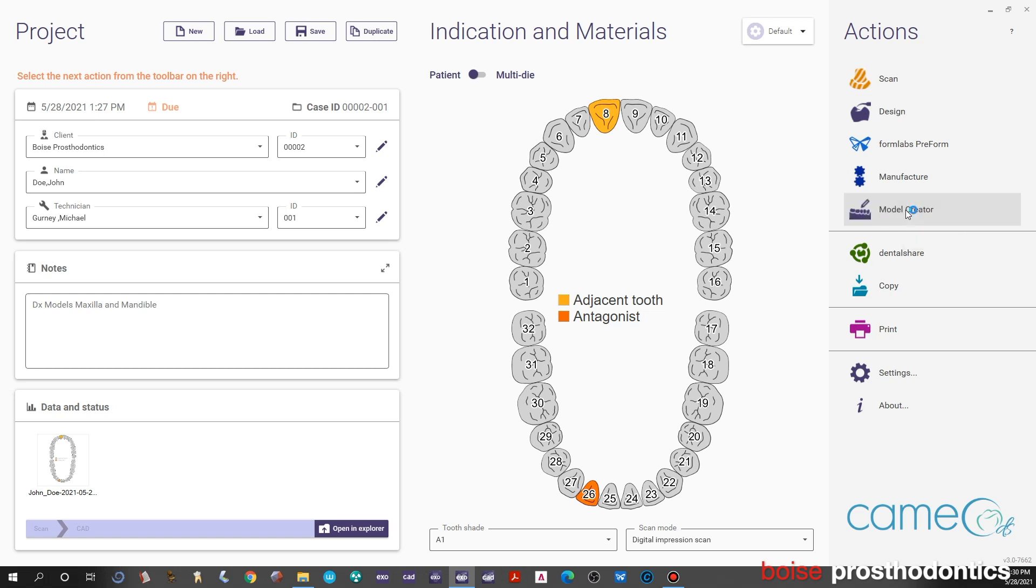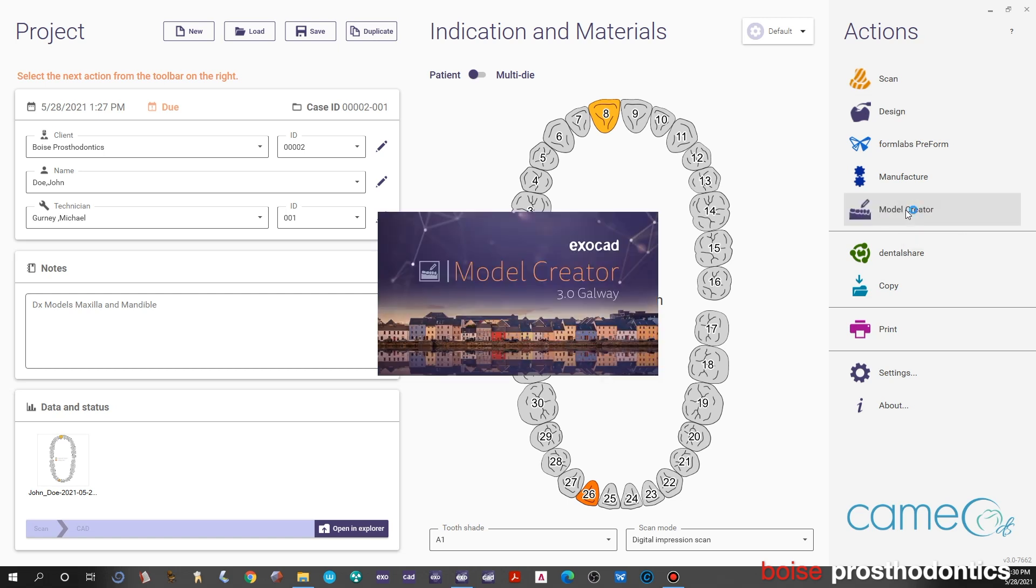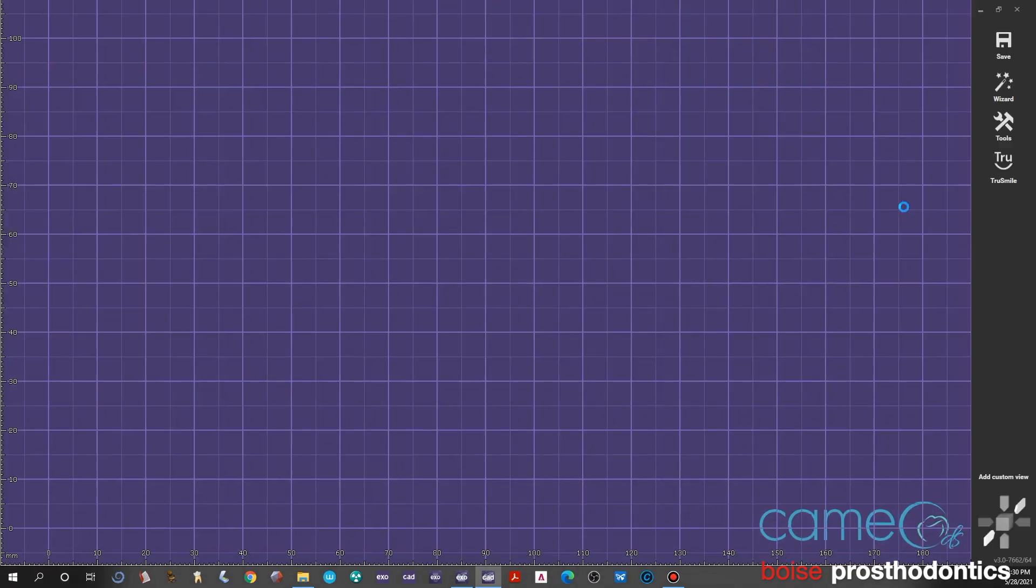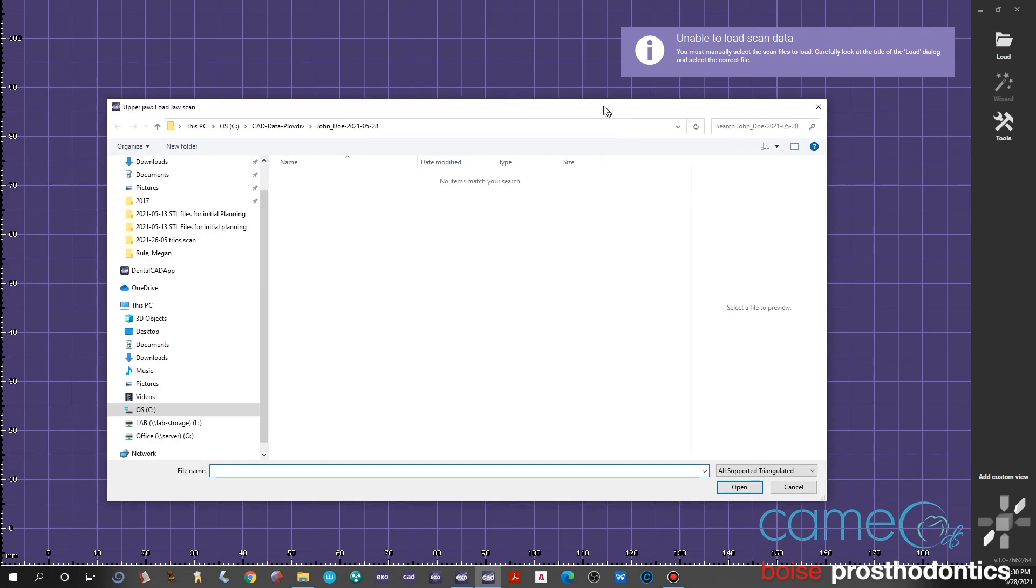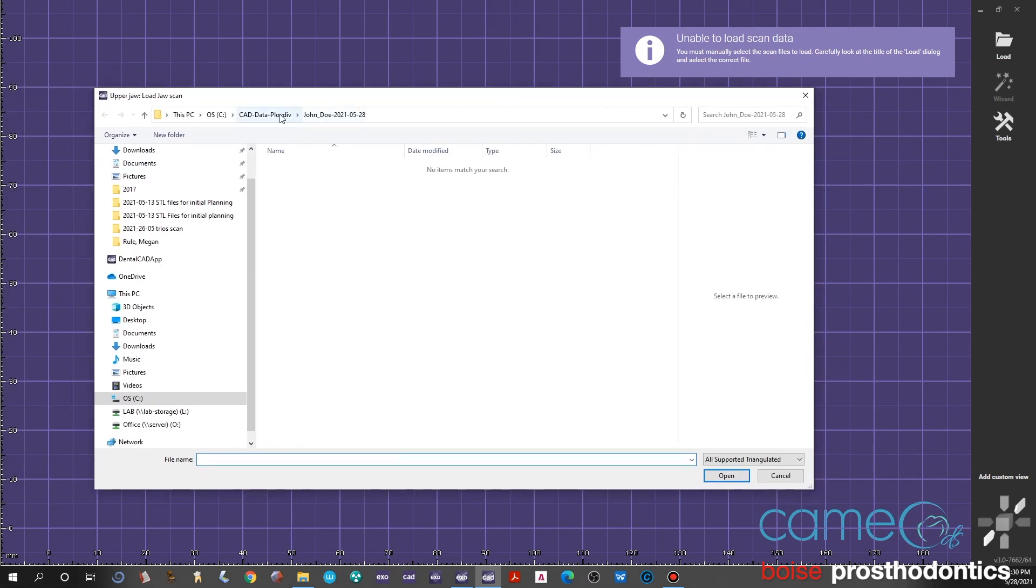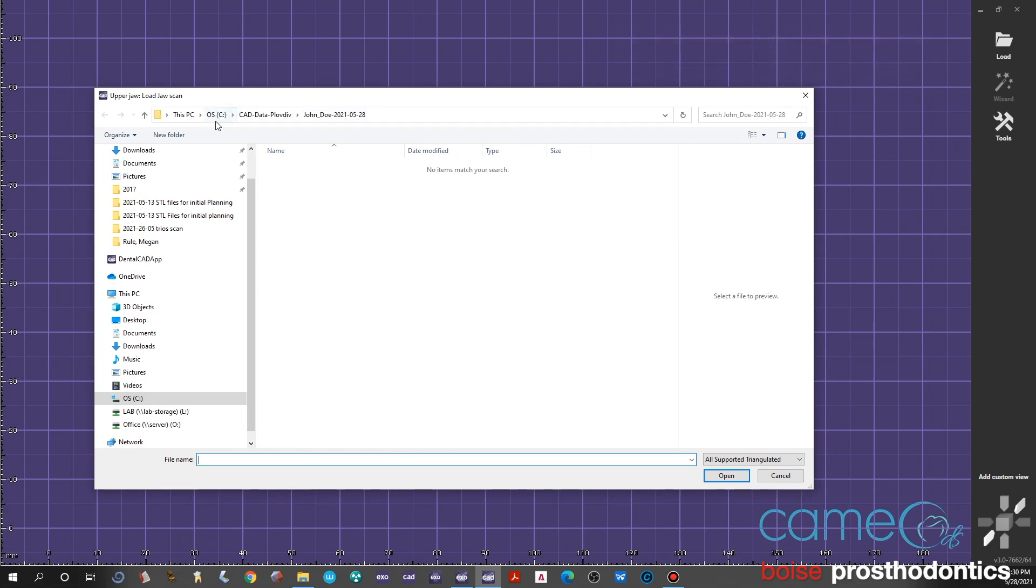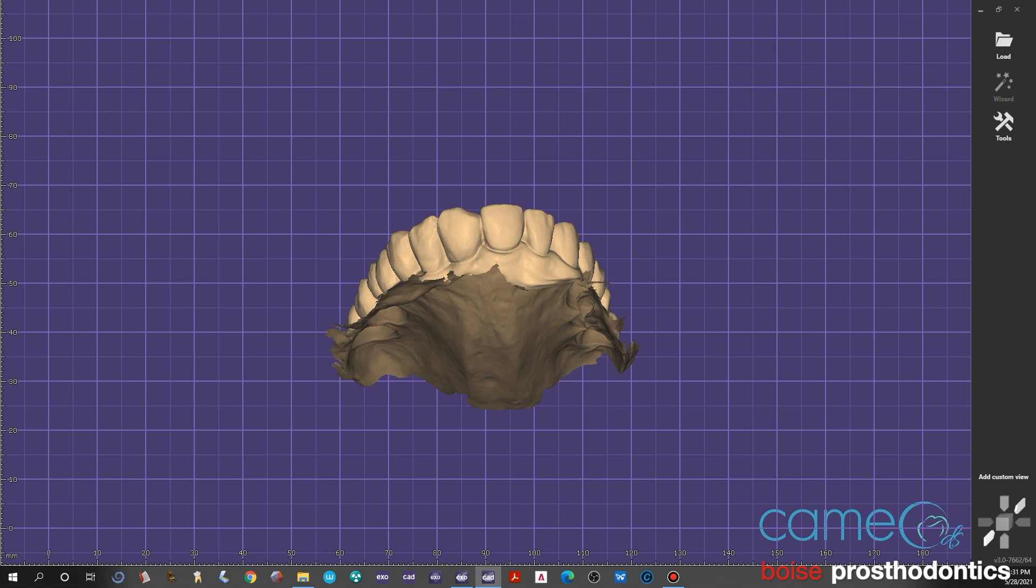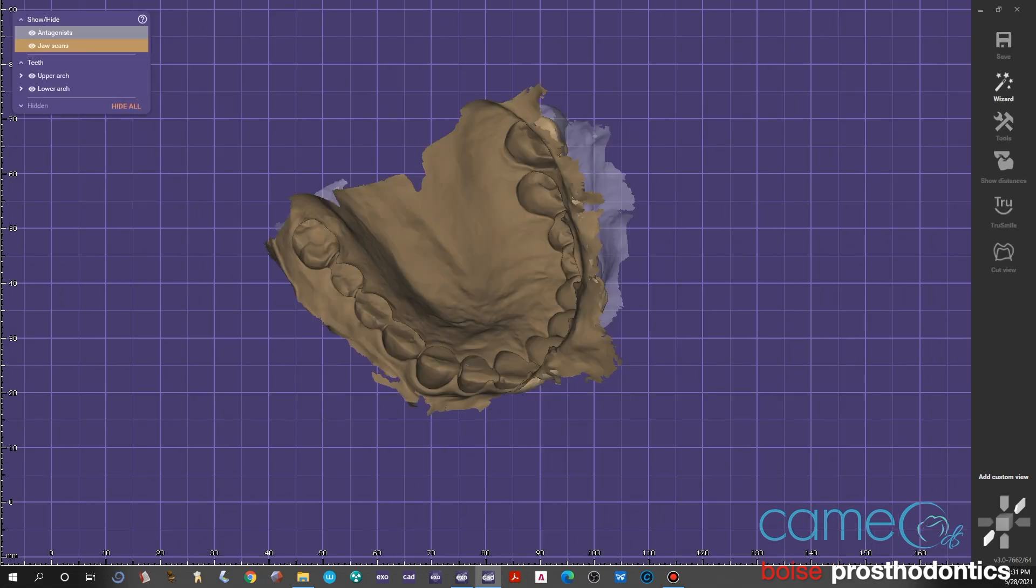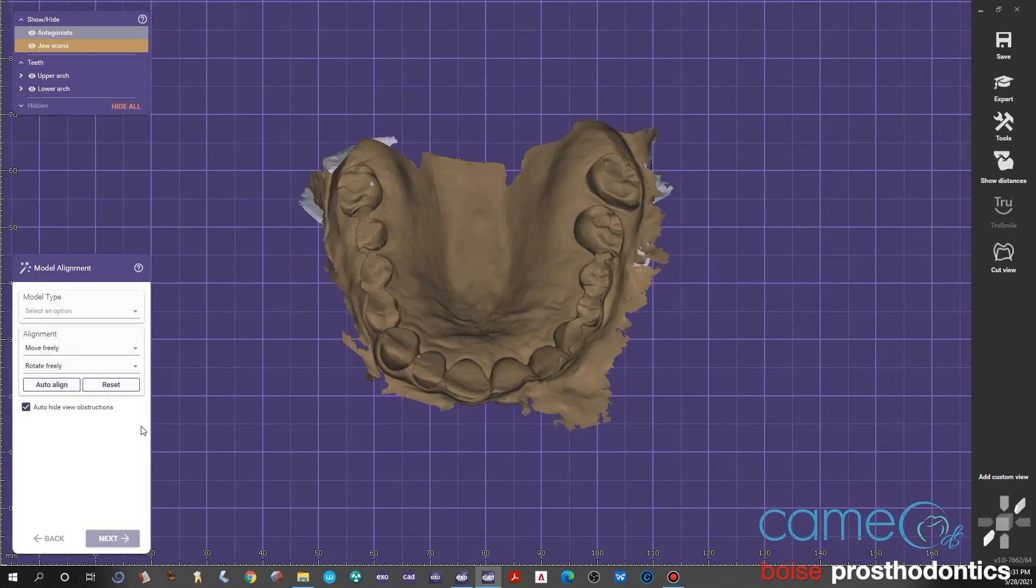Once we click on model creator, the CAD software will open up and prompt you to select the correct jaw STL files. The first one it asks for is the upper jaw scan—see in the upper left corner it says upper jaw scan. We're in the C drive of the computer where it stores these files. We need to find the STL files, so we go and find the upper jaw STL scan. In this case it's a digital impression obtained by a Trios. Then you upload it and it'll prompt you for the lower scan, which we loaded as well.